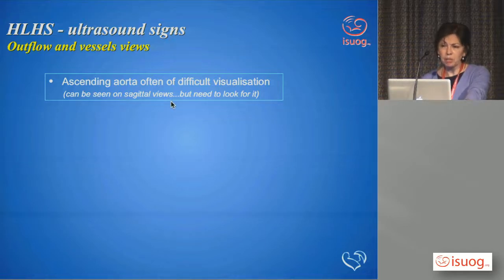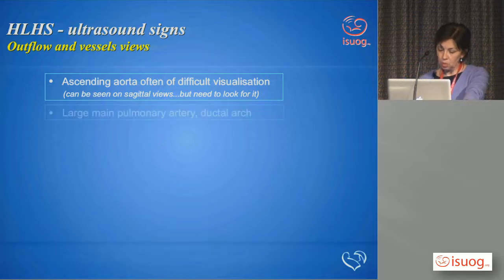If you have a hypoplastic left heart, we do try and image the ascending aorta the best we can, because that is one way of again adding risk factors for surgery. The smaller the aorta, the worse the prognosis, according to some surgeons. Some surgeons would say it doesn't matter, they'll do a good job, but I don't think that is quite correct.